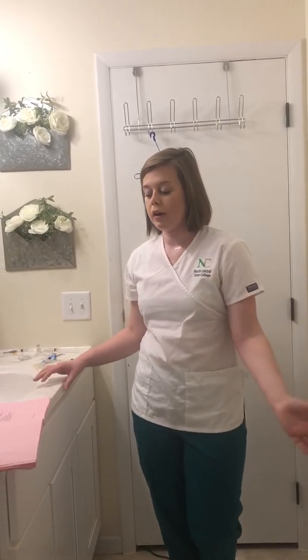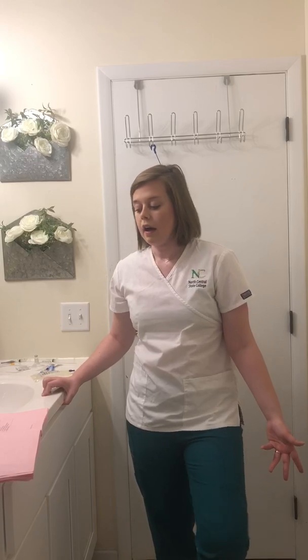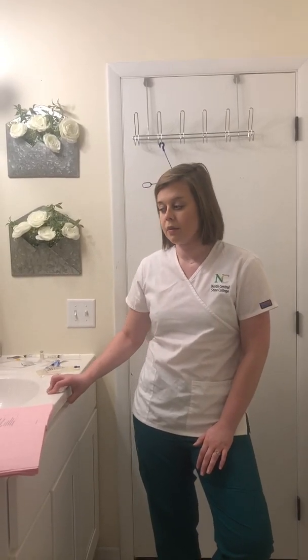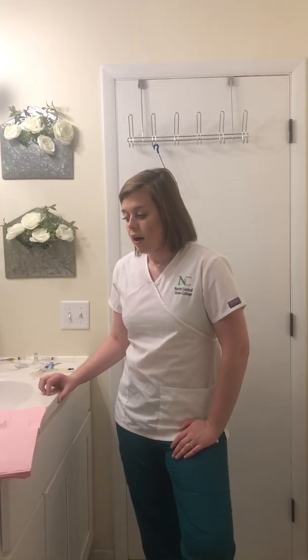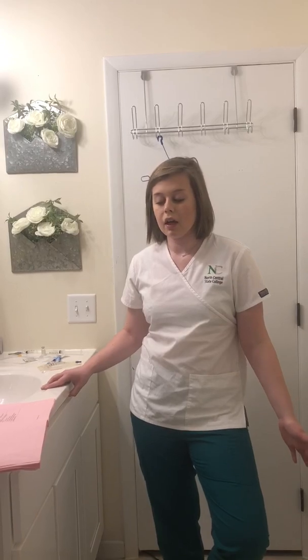I would walk in, introduce myself. I would wash my hands, close the door behind me. I'm going to explain the procedure to the patient. I'm going to explain that we're giving Rocephin, and we would normally give that over 30 minutes. And then I would want to make sure whatever's infusing is compatible with what I'm giving.